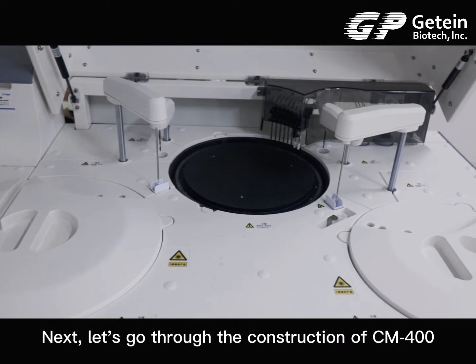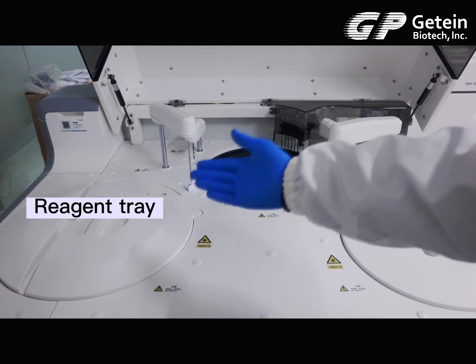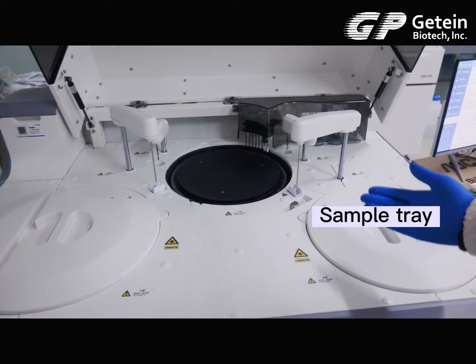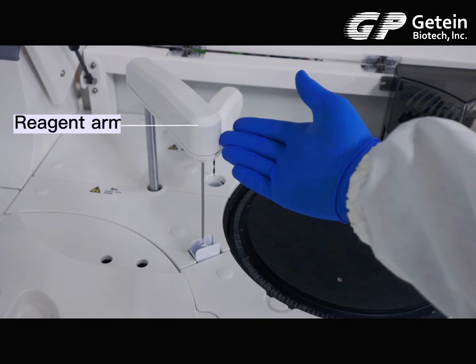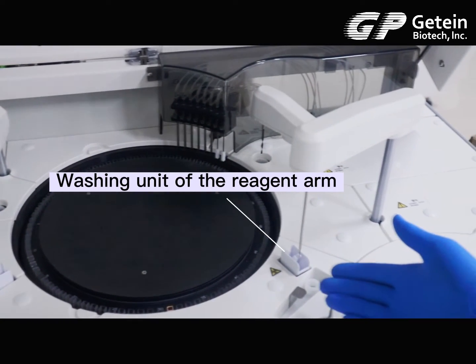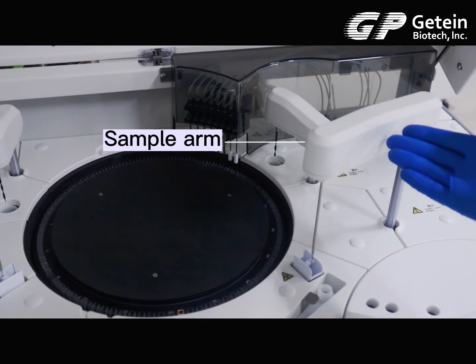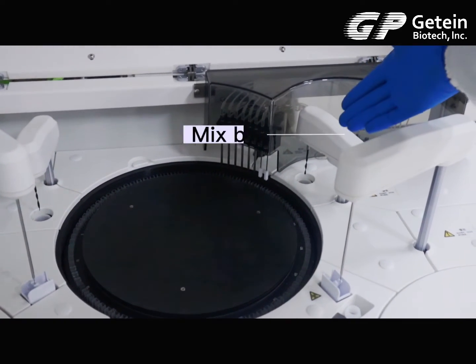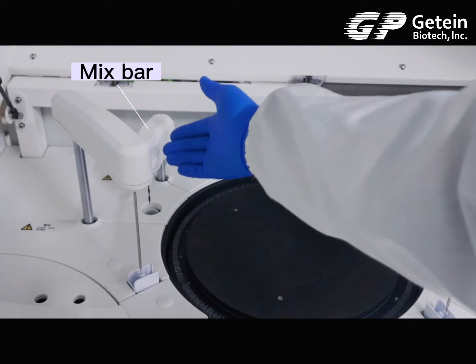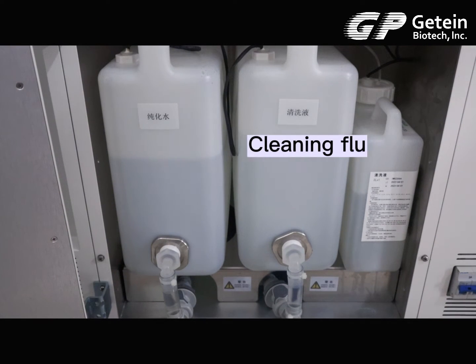Next, let's go through the construction of the CM-400. Reagent tray. Reaction tray. Sample tray. Reagent arm. Washing unit of the reagent arm. Sample arm. Mix bar. 8-step warm liquid washing. Mix bar. Purified water. Cleaning fluid.